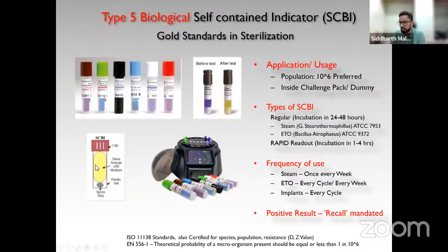After that, if you crush this ampule, if you give the bacteria its growth culture, or in simple terms, if you are giving the spores or the bacteria some material to eat or food, they will not grow in size. So what that means is, just in case all the bacteria has got killed with the autoclave procedure, and if you still provide them the culture or the food after mixing them, there is not going to be any change in the color. The purple color will remain purple. However, under your sterilization cycle, if your sterilization wasn't proper, and if the bacteria did not get killed, and then if you give them food to eat, their color is going to change. It will change either from purple to yellow, or the complete solution is going to become viscous or turbid. That means there is a positive growth in the bacteria. There is a positive growth in the biological indicator.